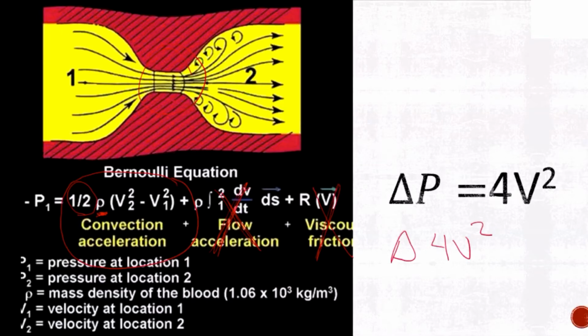That's because the velocity is so low proximal to the change that we don't even account for it. If the velocity is less than 1, 0.1 times 0.1 is basically a number that doesn't matter. So when we add that into the calculation, you don't have to account for it because the velocity pre-orifice is so small. Now, when you're talking about other changes in orifice shape, like a patent ductus arteriosus or a PFO or something like that, you're going to use that same velocity.